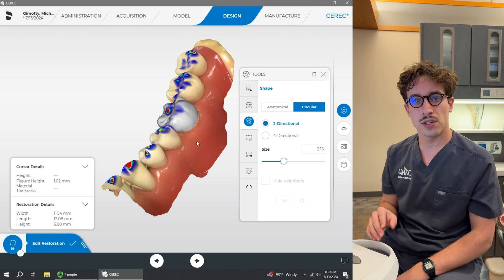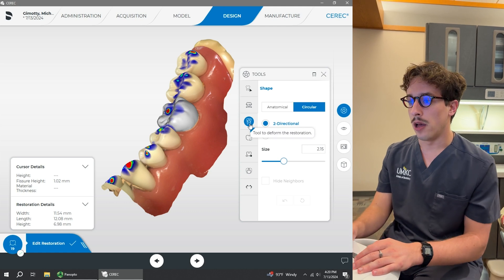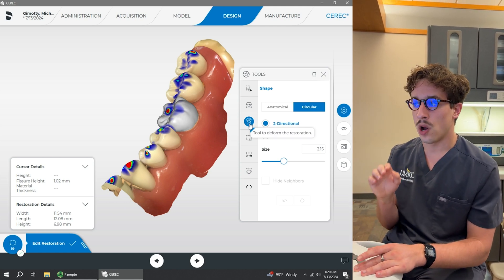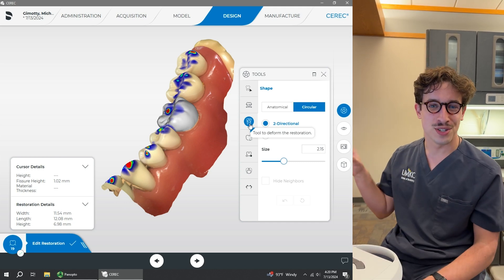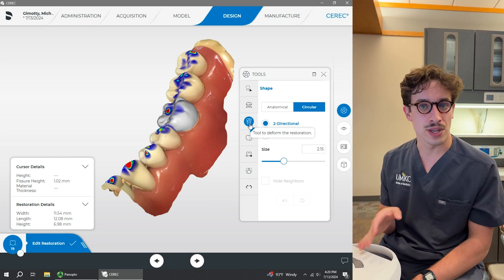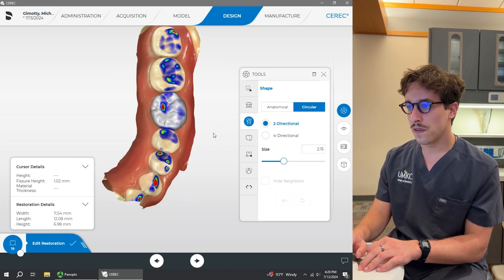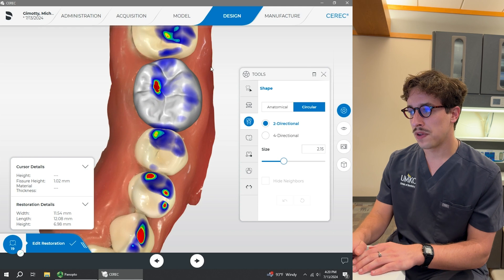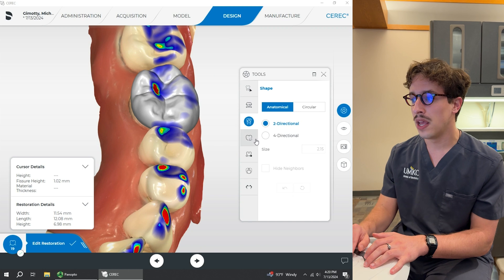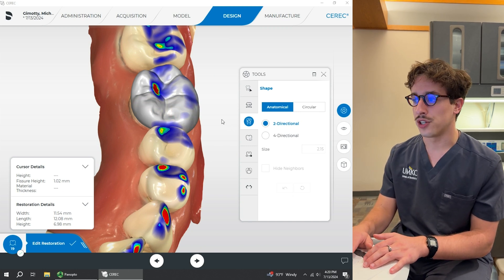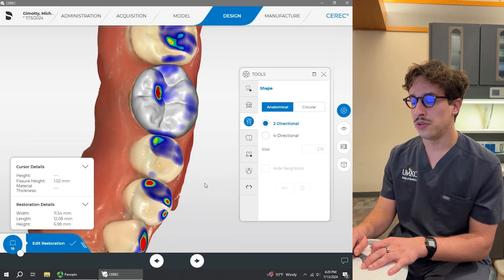Now that the biogeneric variation has been set to what we'd like, we're going to come over here to the shape tool. One thing to note is that we always like to use the form tool — that's kind of our go-to, what we're used to in the lab — but you'll see that's actually going to be the last thing we use, and frankly I don't even really use it that much. For the shape tool, we've got two options: anatomical or circular. We're going to choose anatomical, and we've got two-direction and four-direction. I prefer two-direction because it does make it a little bit easier to use.